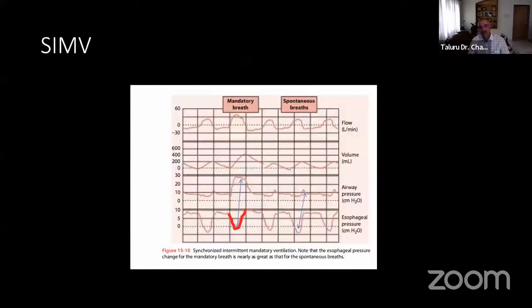You see this slide now? See, this is all pressure support breath. There is a mandatory breath here. See, the diaphragm is still contracting. See, there is no rest. In fact, studies have shown that there is an injury to the diaphragm at this stage because the I time and E time are fixed. See, here it is breathing the way it wants.